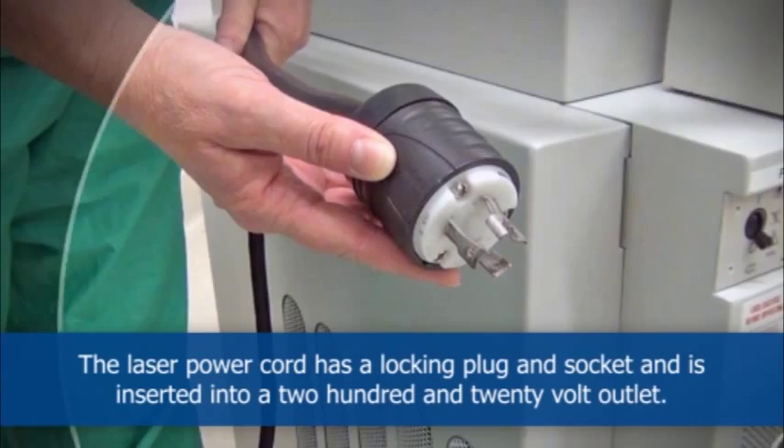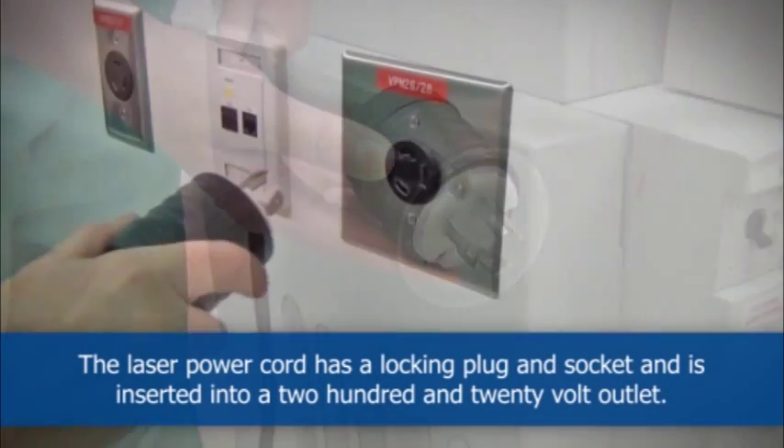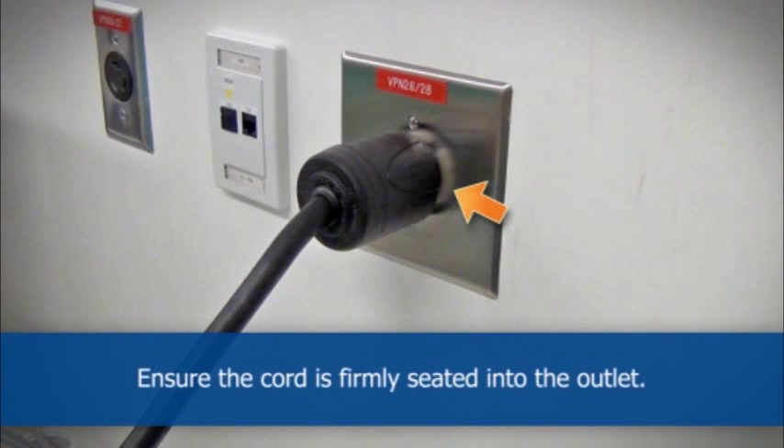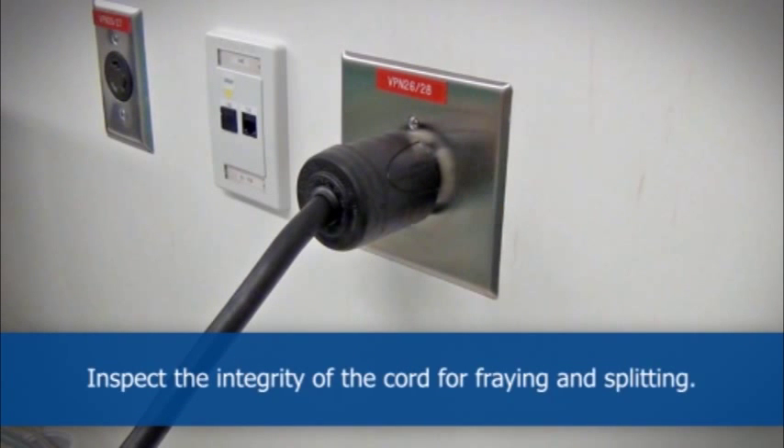The laser power cord has a locking plug and socket and is inserted into a 220 volt outlet. Ensure the cord is firmly seated into the outlet, and inspect the integrity of the cord for fraying and splitting.